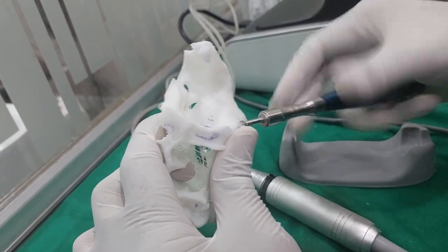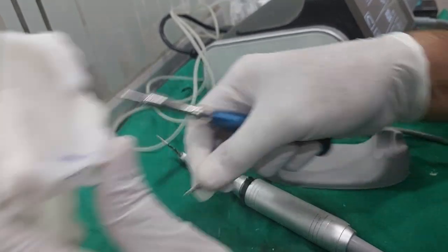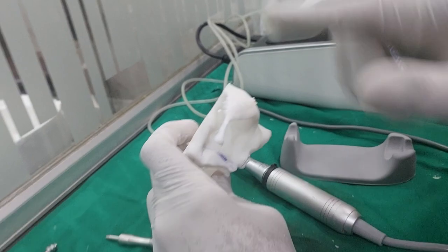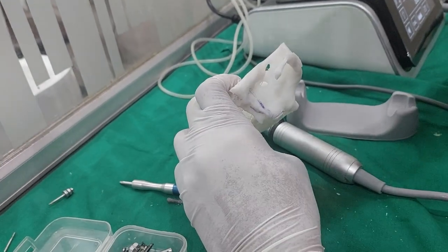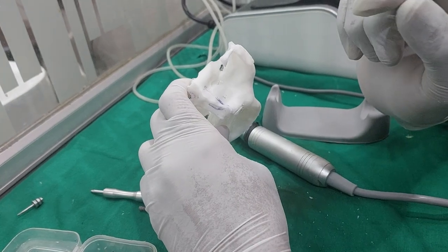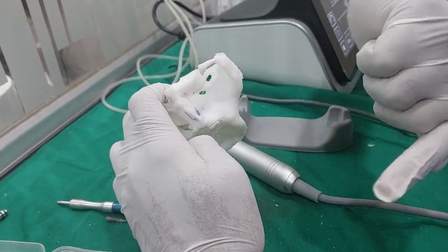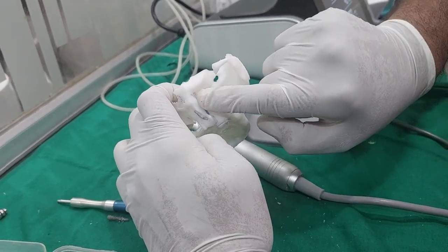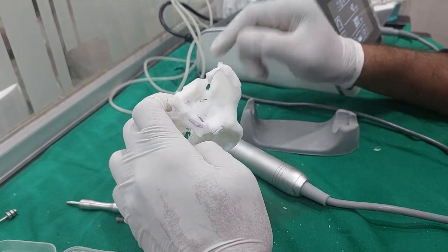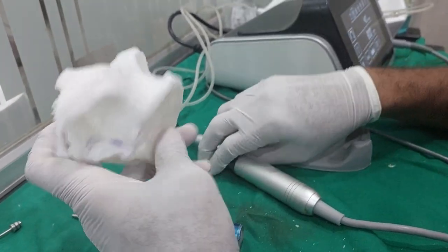I will show you another technique on the different side. There are two to three techniques. One technique is with the drill - piercing, taking an x-ray for orientation, and then reaching the cortical bone. Another technique is tapping using osteotomes. You tap in the similar direction to head toward the cortical bone area, then use the drill to perforate the cortex and place the implant. Even if you do not perforate but reach the anchored area, you will get primary stability.